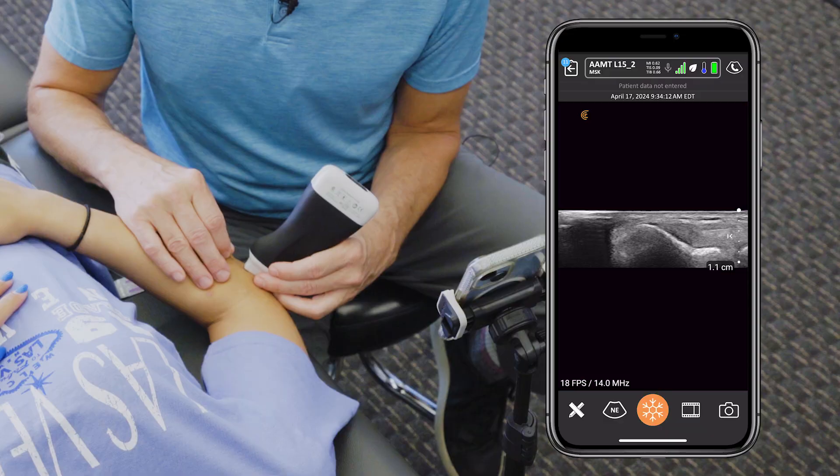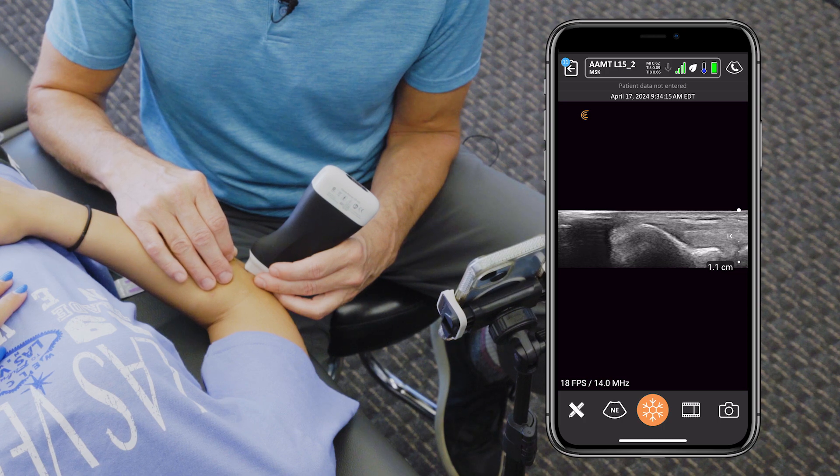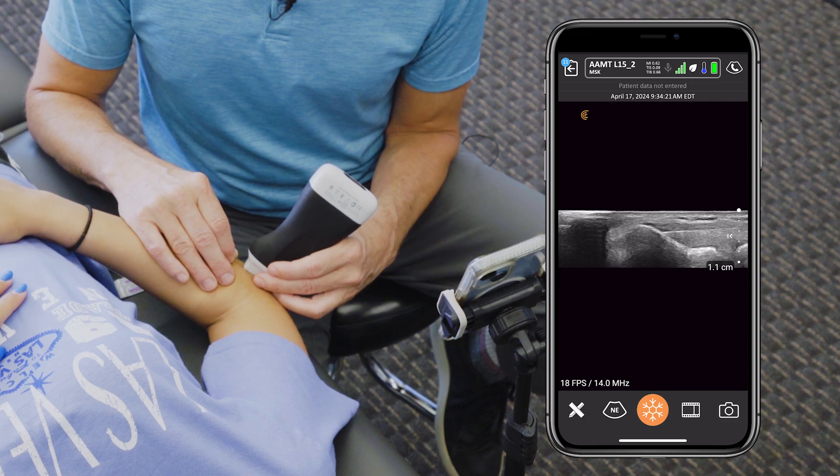You can actually have the person move, twist, bend — and put a needle into that spot to determine if it's reproducing the familiar symptoms. That way you can know for certain their chronic pain has not been all in their head; it's just been misdiagnosed. Diagnostic ultrasound is the way that you get these people better.